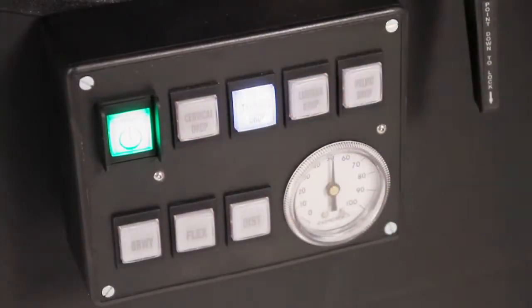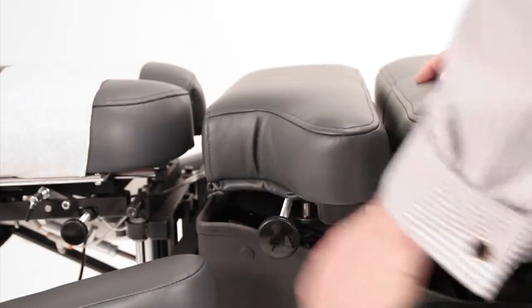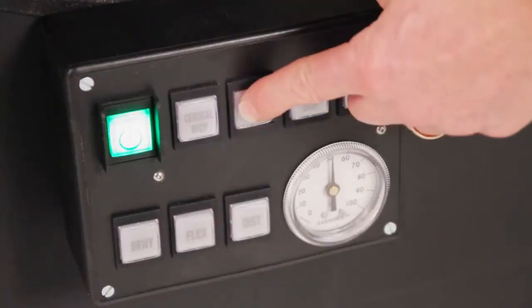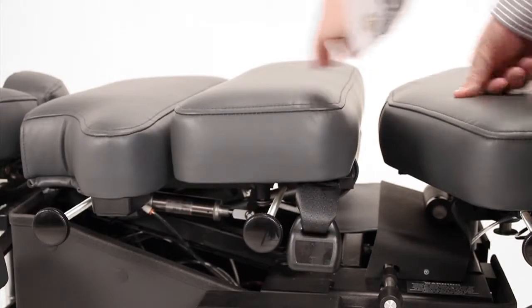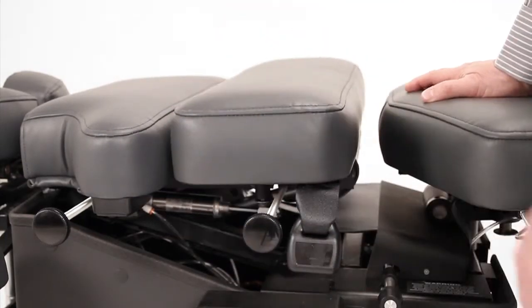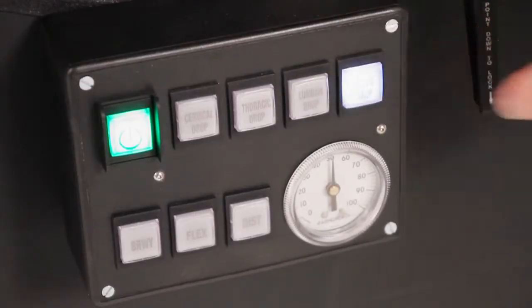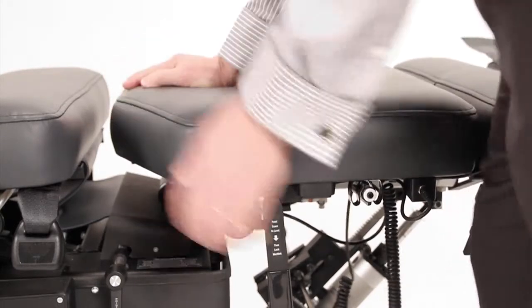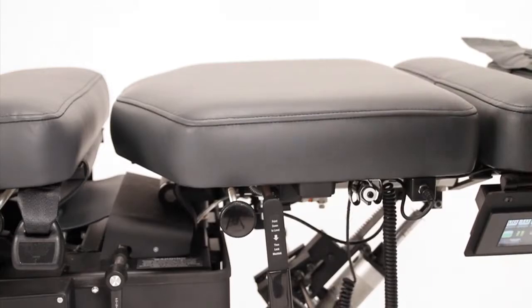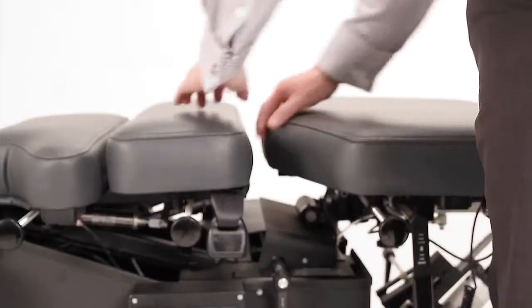The second air drop available is the thoracic drop. Again, use the tension knob to adjust the level of firmness. The third available air drop is the lumbar drop. The fourth optional air drop is the pelvic drop. With the air drop system, you have the ability to use multiple drops simultaneously.